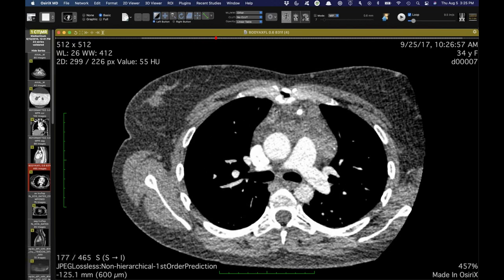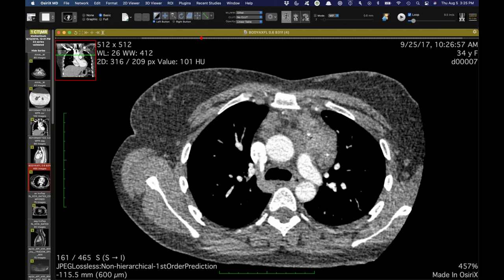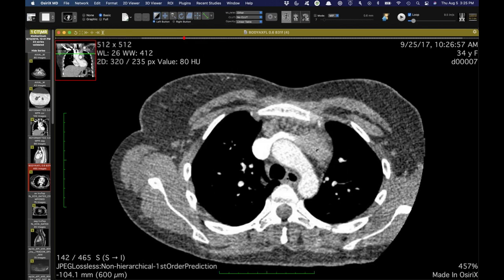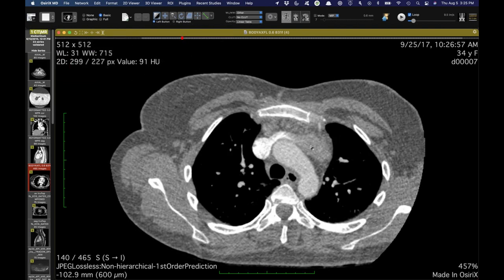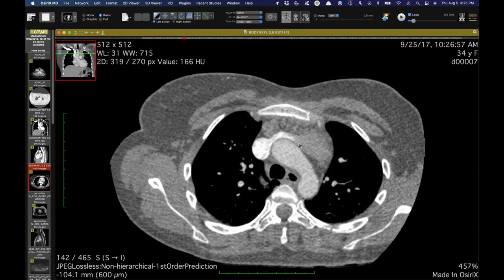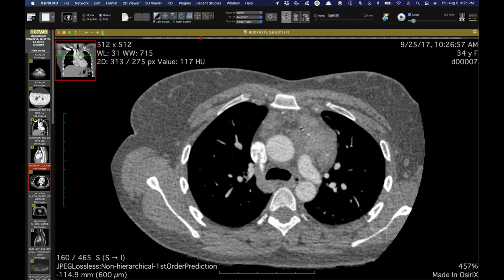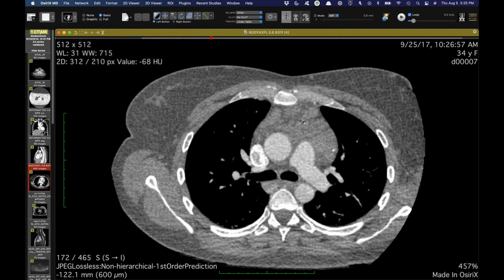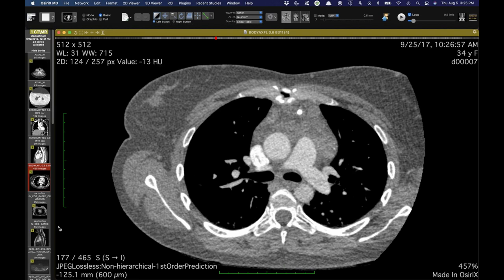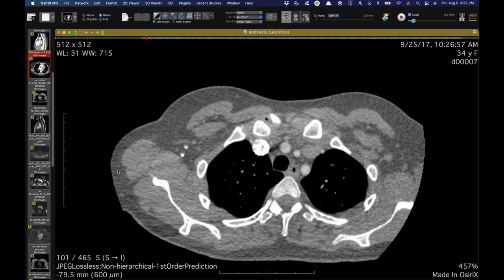Of course, this doesn't look like a true, discrete tumor per se. And the more you look, you see some of these dilated channels look like they're vessels. In fact, as you can see here, there's some direct or macroscopic communication with the left brachiocephalic vein. So this is a really good look for at least a venous malformation or hemangioma like we've seen. And this one actually has quite a bit of lymphatic connection as well. So this ends up being a lymphatic venous malformation.